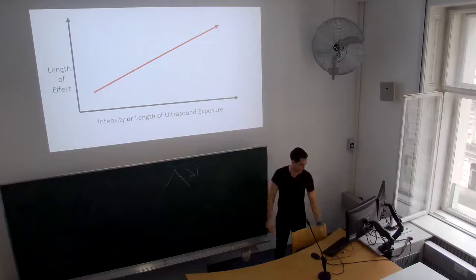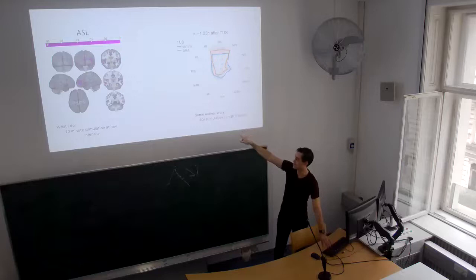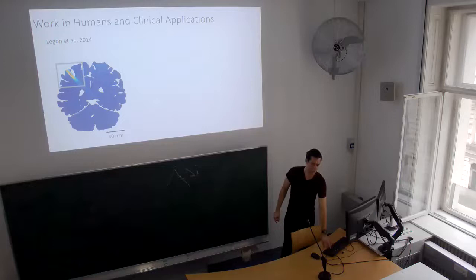For instance, what I've done a lot is stimulate for a really long time, but at a low intensity, and I see after effects. And then these monkey studies stimulate at a really high intensity, 10 times what I do, but only for 40 seconds. And it lasts hours, right? Interestingly, there's still no histological damage or any evidence for a permanent effect in the monkeys, even though it's 10 times what I do.